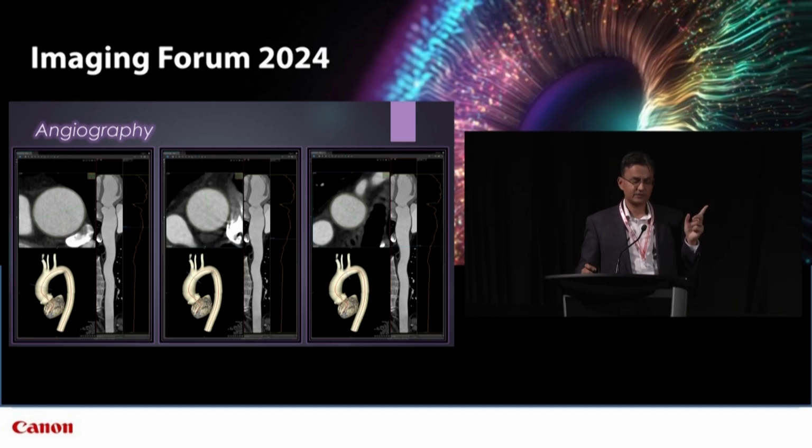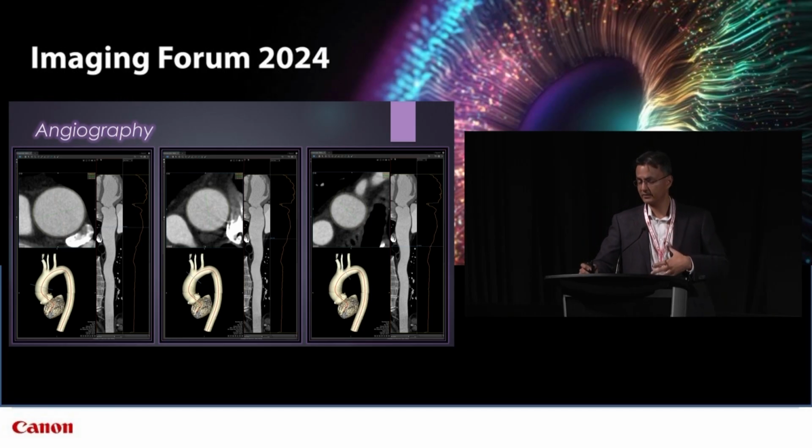Vitrea also allows the ability to not just measure within the lumen, but actually include the wall, and I'll show that in the next slide. But for the aorta, inclusion of the wall, and a lot of this literature comes from the abdominal aorta, less so from the thoracic aorta, where we don't tend to get as much wall plaque, but wall stress is a key feature in what we need to be able to assess. And if you exclude the wall, you're sort of underestimating the actual wall stress that would be there. It's a surrogate measure, but it is more accurate to include the wall.